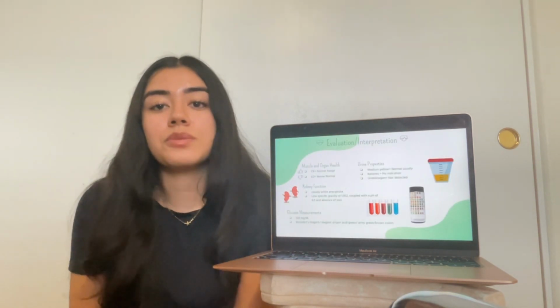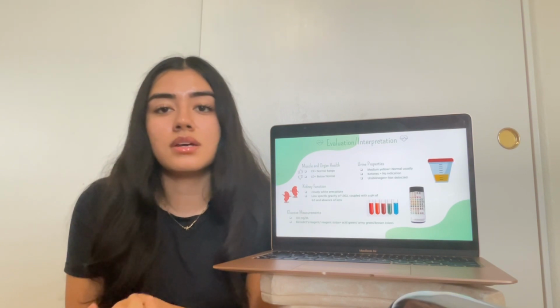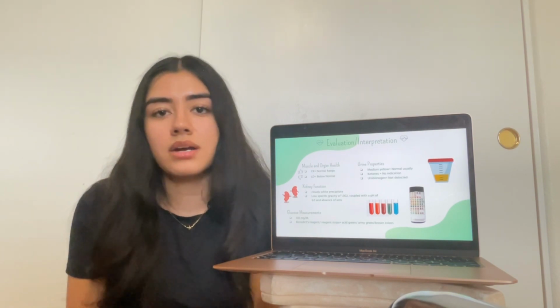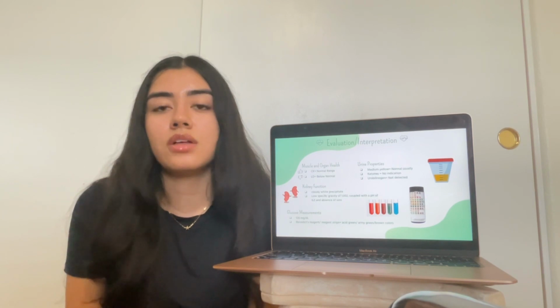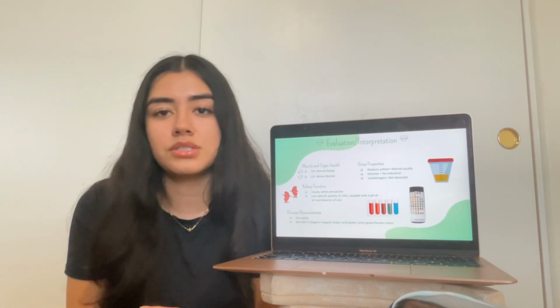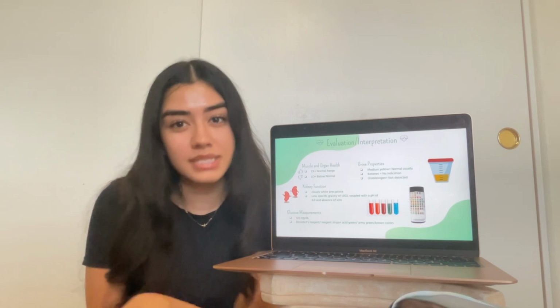As I mentioned before, the patient's blood glucose level was at 120. Additionally, the urine test using the reagents, the strips and the Benedict's, showed acid green and brown. All of this suggests the presence of glucose in the urine. For the muscle and organ health, the CK level was within normal range, indicating no muscle damage. However, the LD was below normal range, which might suggest some impairment in the tissue function or metabolism.